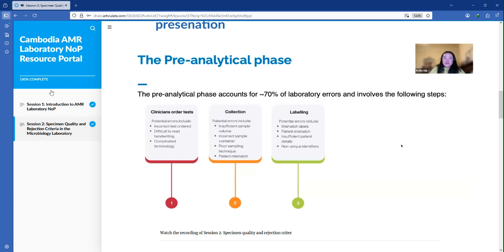To determine if a sample is of high quality, one can use a scoring system to determine whether the sample is useful for culture. Some exceptions to this would include sputums from immunocompromised patients, from pediatric patients, or maybe some cystic fibrosis patients, where it's difficult for them to actually bring up the sputum. An important thing to note is to have no food particles in these sputum samples.